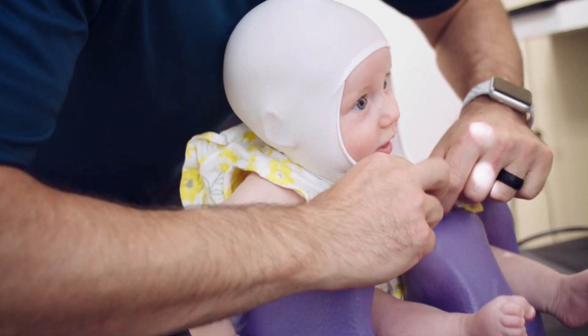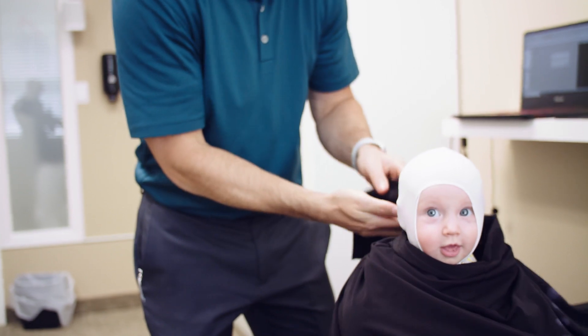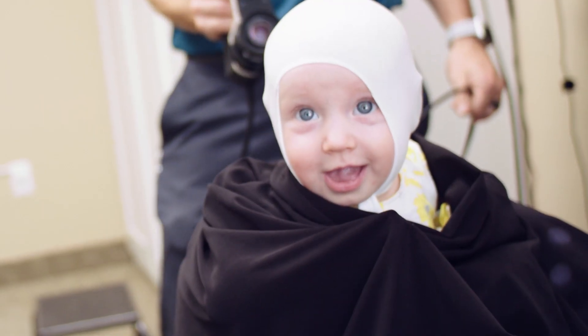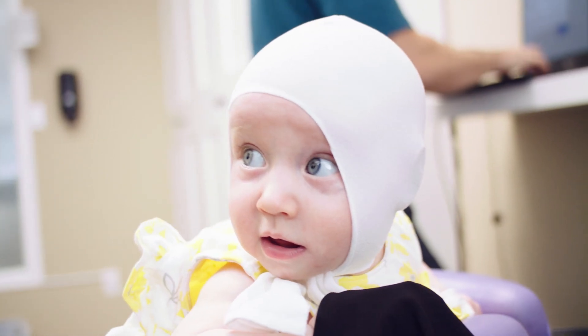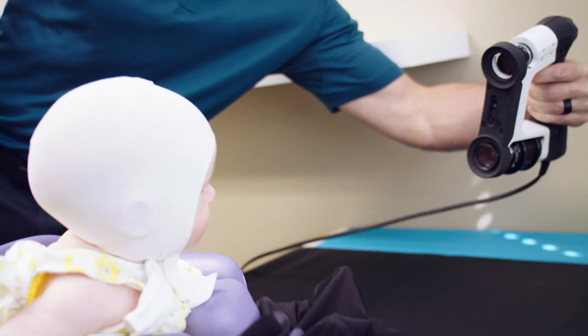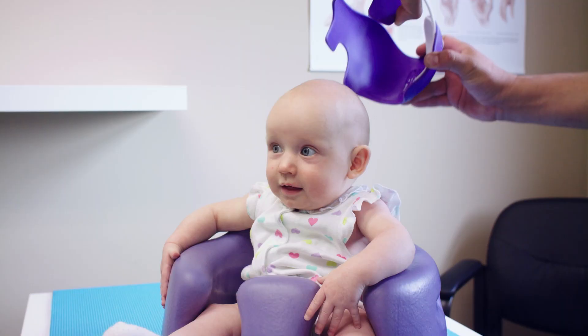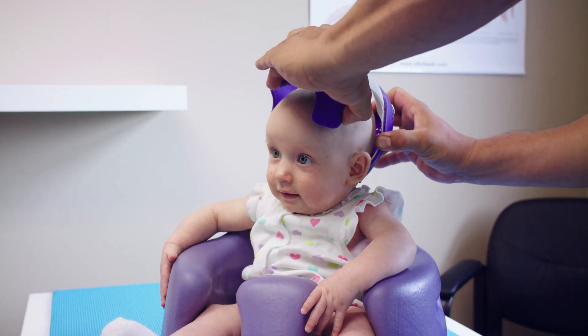If your baby has a flat spot on their head, or you've been diagnosed with plagiocephaly or brachycephaly, this helmet might be what you're looking for. If you have any questions or concerns about the head shape of your baby, you can come in for a free consult. We can scan your baby's head and provide some education on whether this would benefit you and your baby.